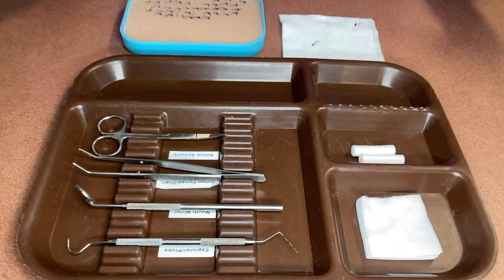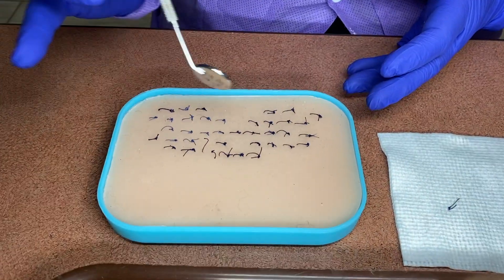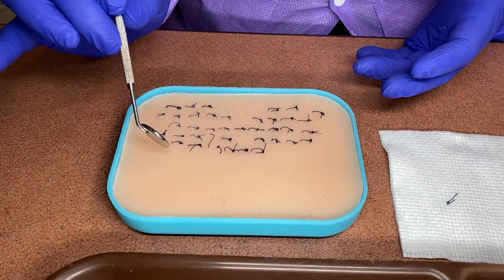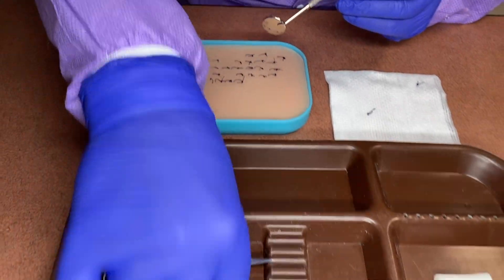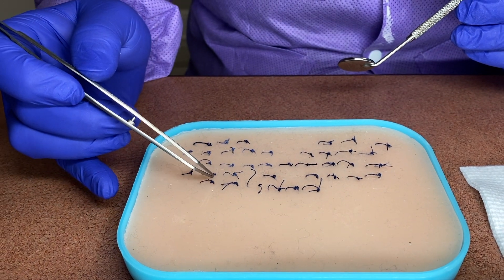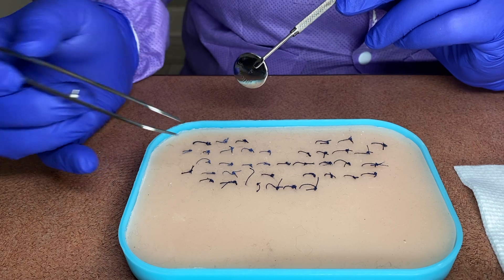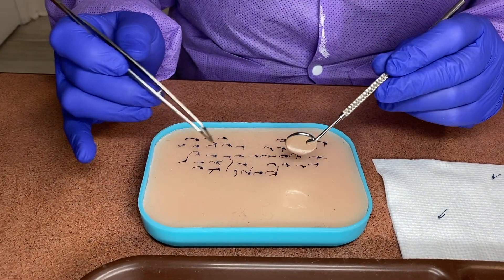The instrument we're going to use is a mouth mirror. You use the mouth mirror to always check inside the patient's mouth to see how the site is healing and to make sure the sutures are ready to be removed. If they're hanging loose from the mouth, we know that they're ready.